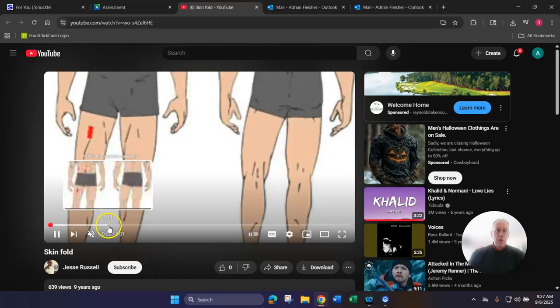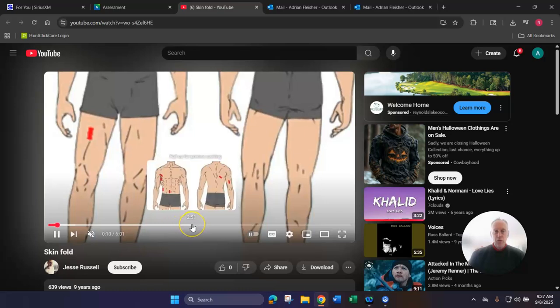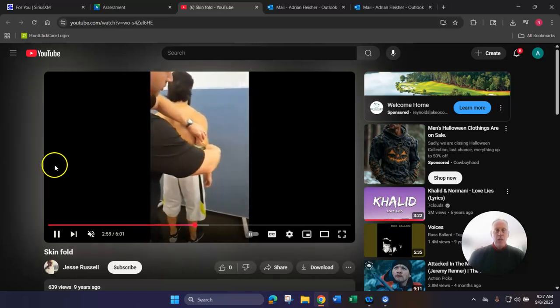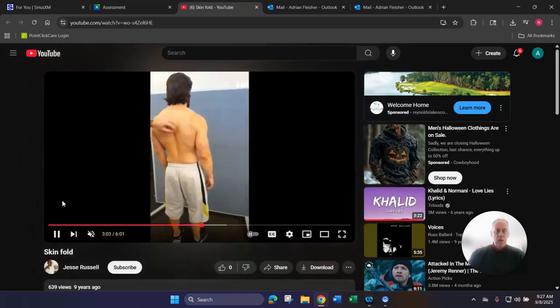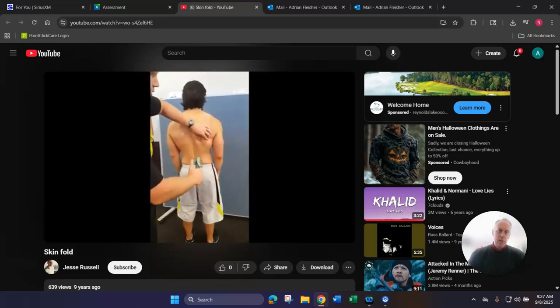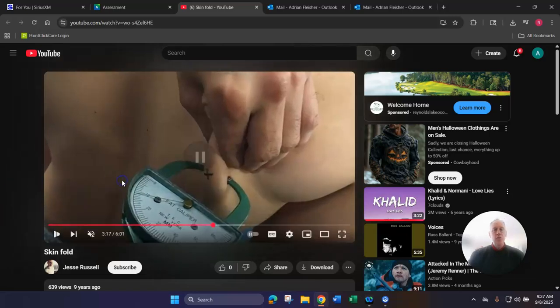This will be a video where you'll get into the beefy part of this because they'll describe the different sites here. It's a great supporting video, but you get further along, roughly about 250. That's when we start doing body composition, give or take. And when you do this, you want to see how many they have there, right? 15. Great, got the tricep. And then you'll look and see here. Scap, got it. Then notice the fold, perpendicular, fingertip pinch up top. The measurement is roughly about 10. So you'll use this to obtain those measurements to put in your spreadsheet or in that document.